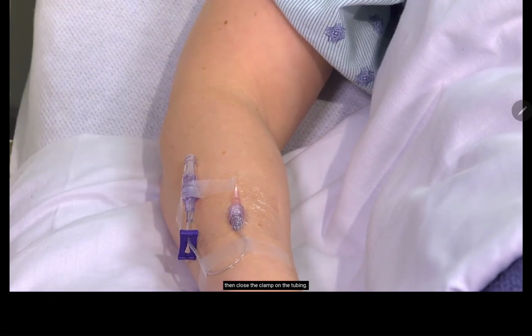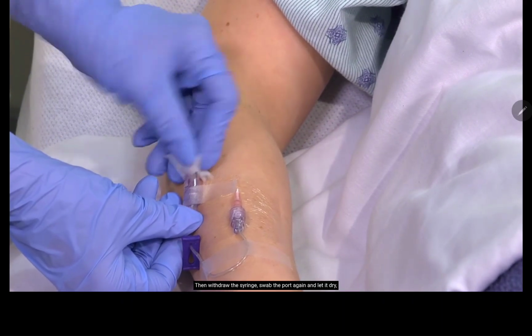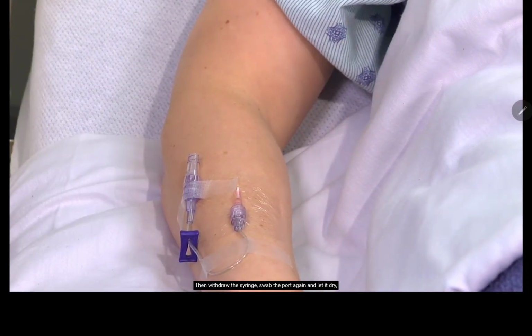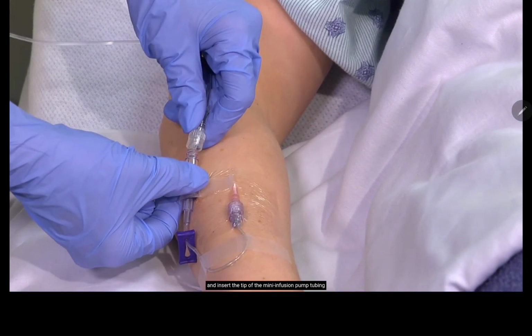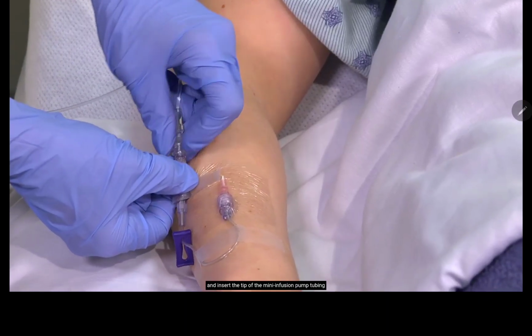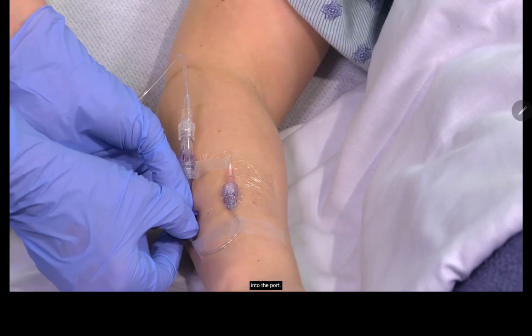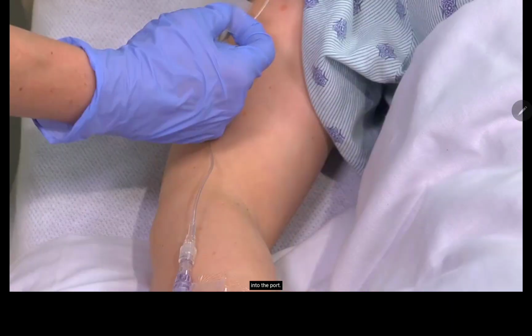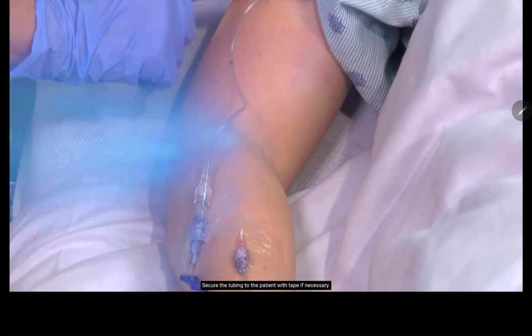Then close the clamp on the tubing. Then withdraw the syringe, swab the port again, and let it dry. And insert the tip of the mini infusion pump tubing into the port. Secure the tubing to the patient with tape if necessary.